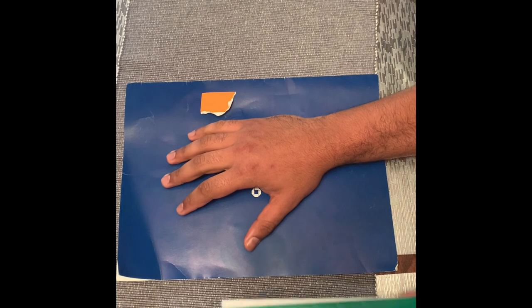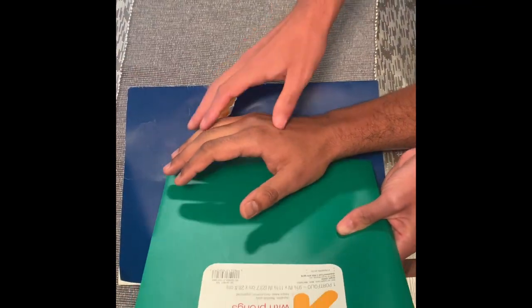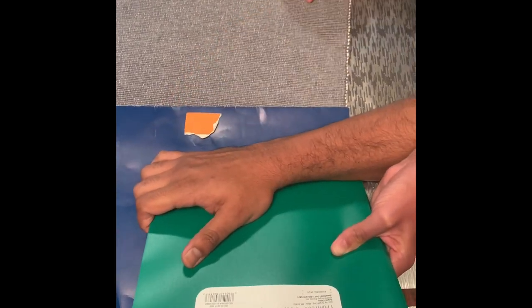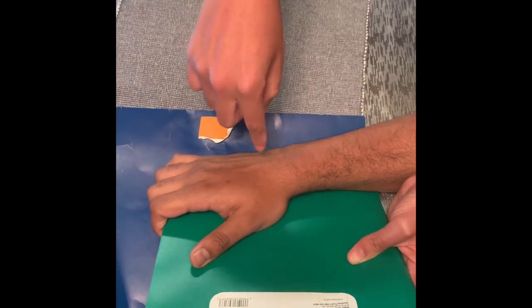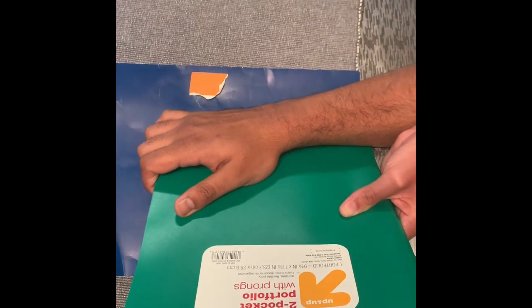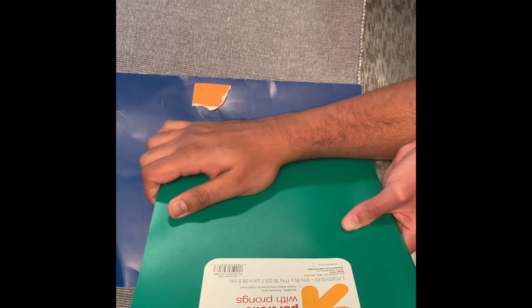Now the PA oblique wrist. We're going to use another device that can give us 45 degrees of the hand. Can you drop like this? The central ray is going to be directed perpendicular to the distal radius. The anatomy demonstrated is going to be the oblique projection of the carpals. Don't move — click — perfect.